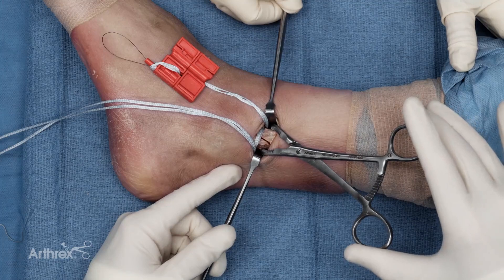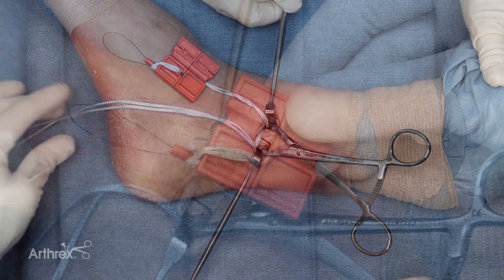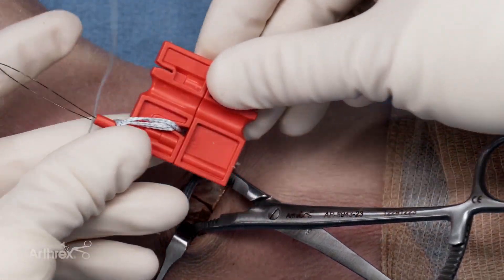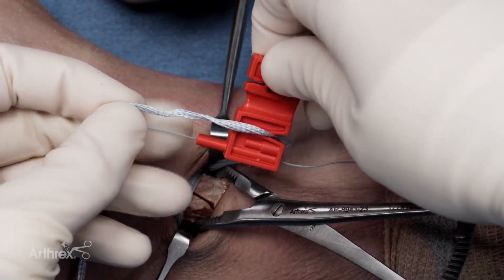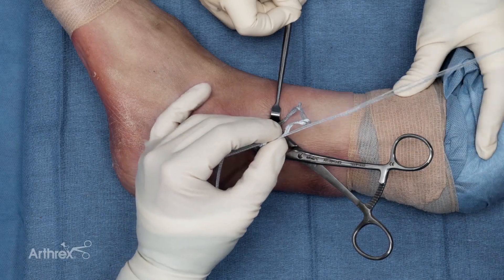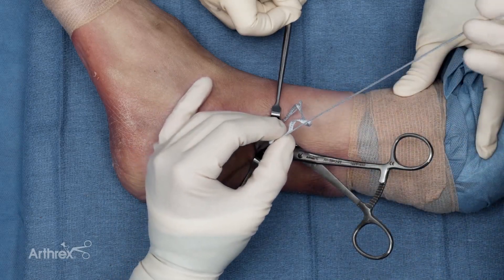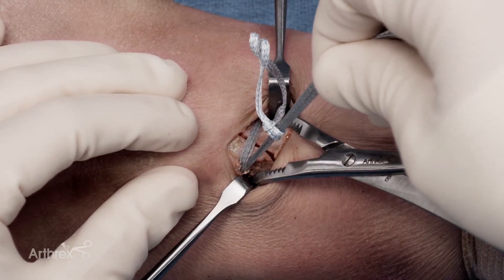While holding this reduction, I can now use the fiber tape cerclage to maintain it. The fiber tape cerclage is loaded using the card and the racking hitch is removed from the card. Pull the entire limbs through the racking hitch, then reduce the racking hitch down to bone with a simple pull.